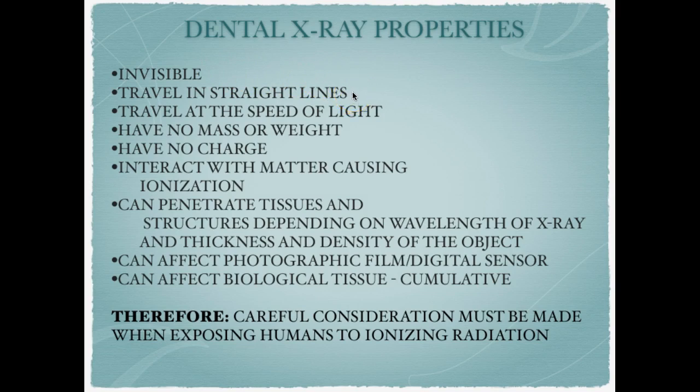So as long as you, as the dental radiographer, the operator, have positioned yourself out of the way of X-rays, you are going to be safe working around X-rays. Now your patient is in the line of the X-ray. However, again, we're going to only take X-rays when it's evidence-based, when a patient really needs X-rays for diagnostic purposes.